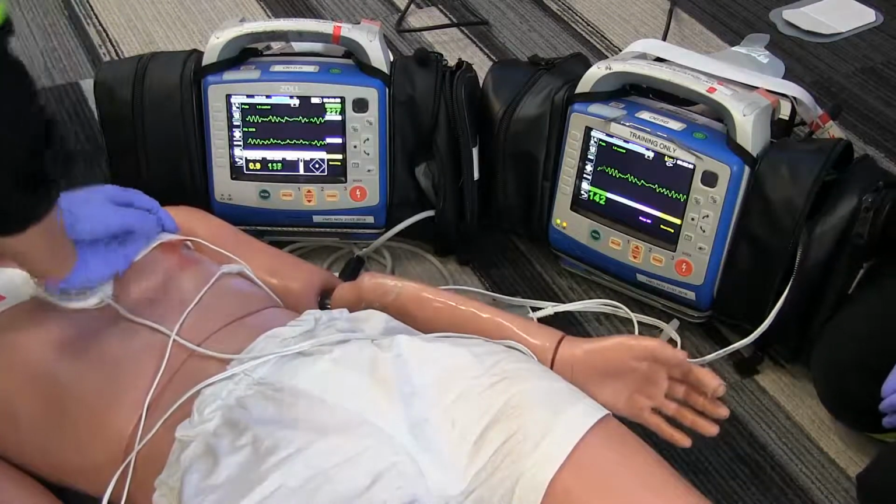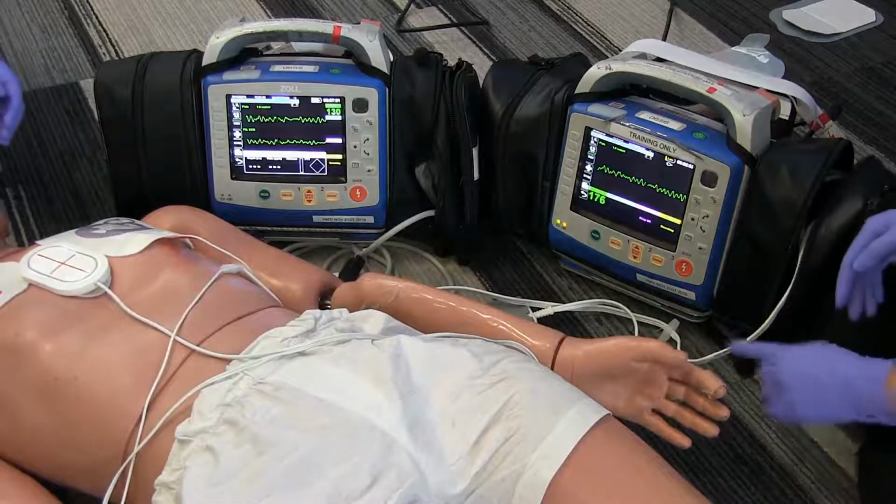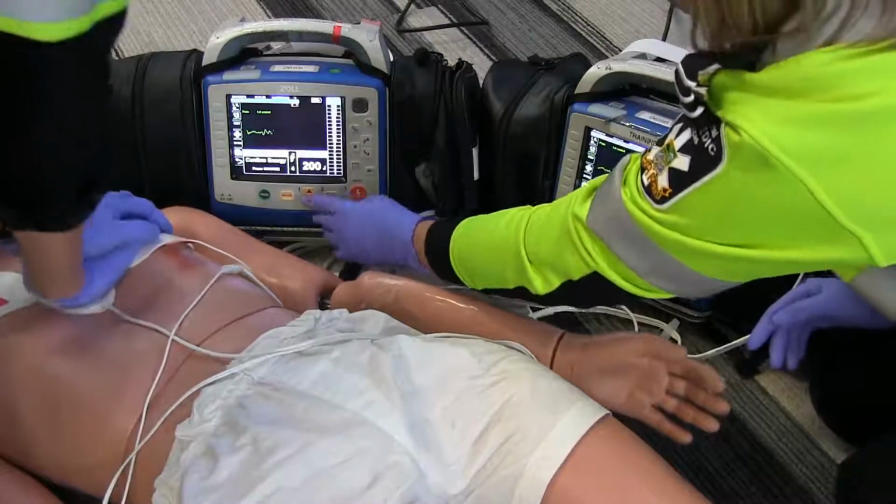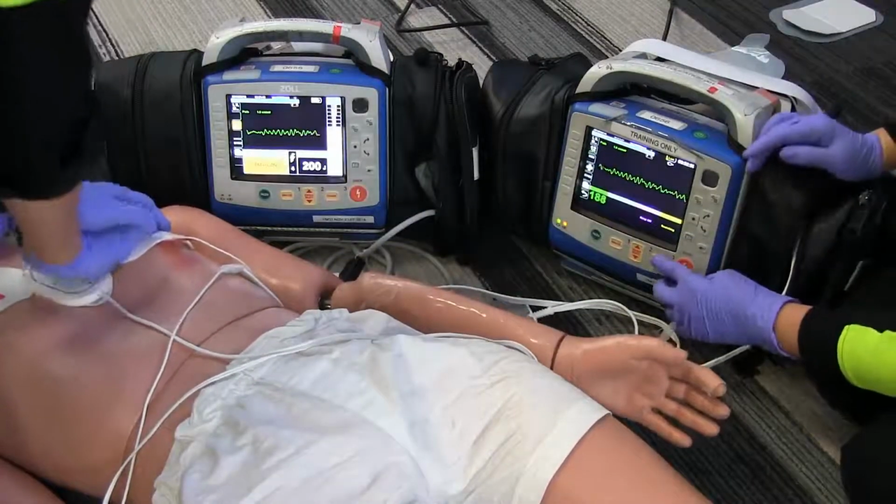Okay, stop CPR, let's analyze the rhythm. Patient is still in VF. Continue CPR. Charge both monitors for the second double sequential shock.